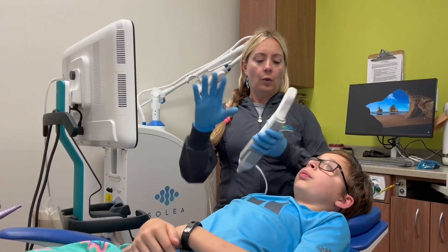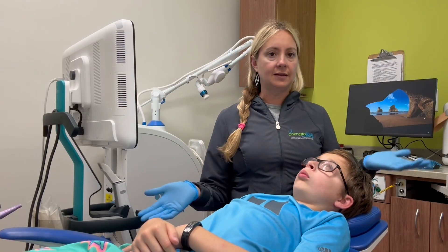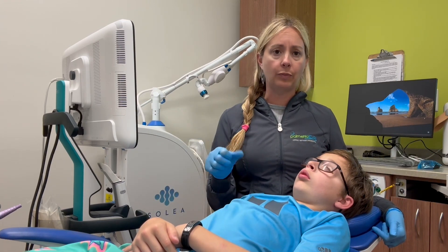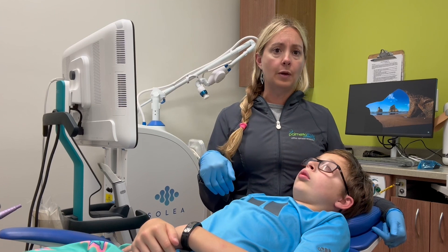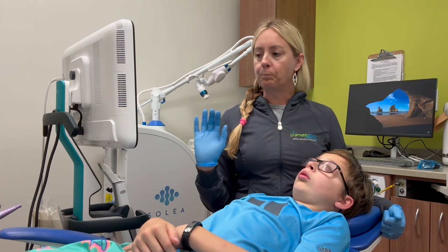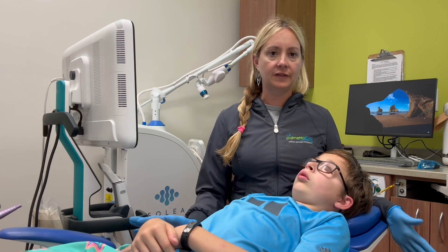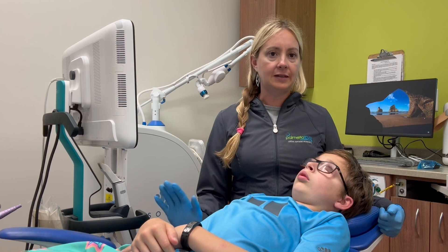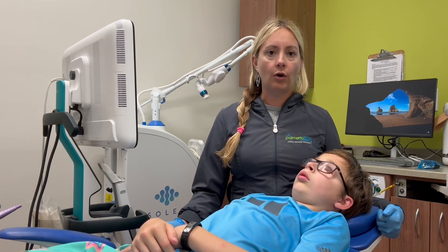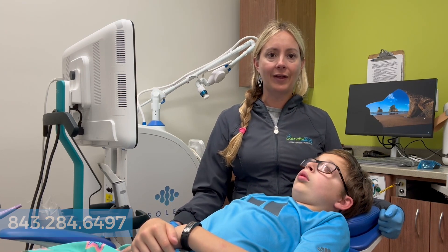Once we do all that scanning, it pops up on our screen and we can send it to the lab for them to make appliances, or send it to our 3D printer here to make night guards, retainers, or whatever we need. It's something new that's been really great for the kids so they don't have to sit with all that nasty-tasting stuff in their mouth. If you have any questions or want to see it, give us a call at 843-284-6497. Y'all have a great day!